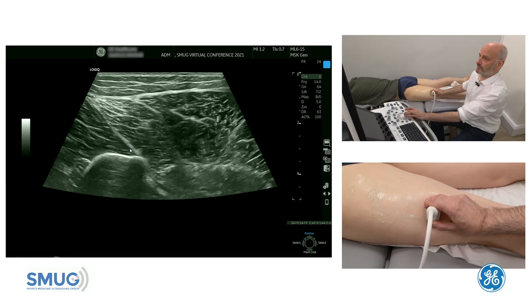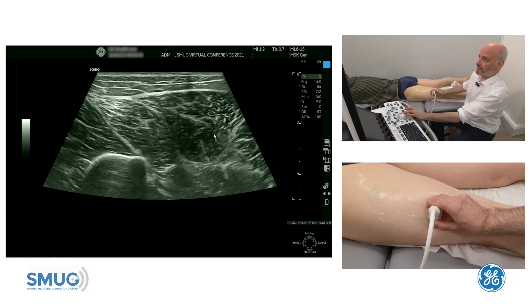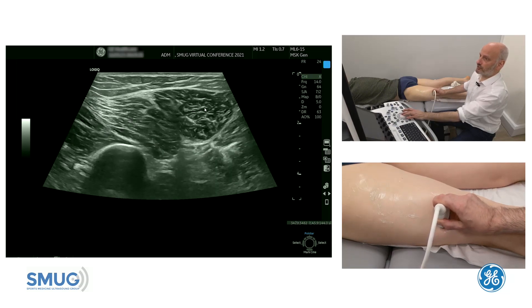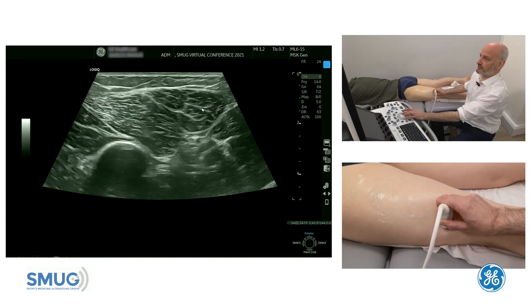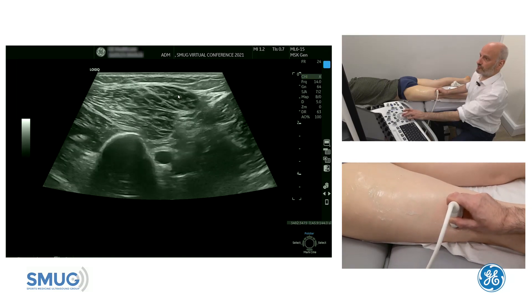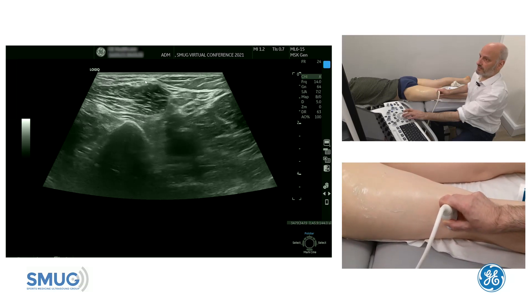Then we keep our eye more posterior, which is the long head of the biceps. As we go distally, the long head will get shorter, and if I just trace distally until it disappears — to visualize that for you — everything draws to the superficial fascia there and it joins in with the tendon.